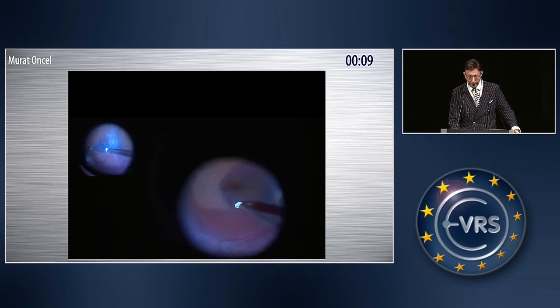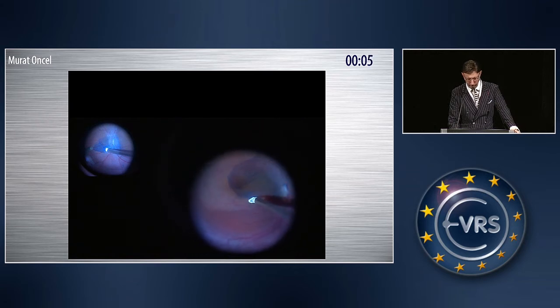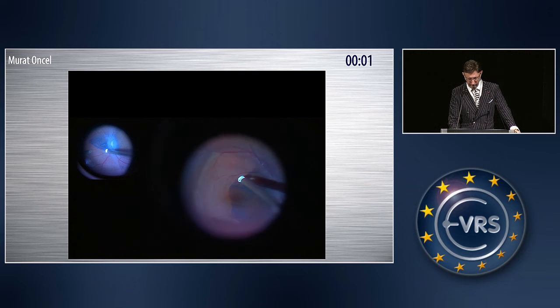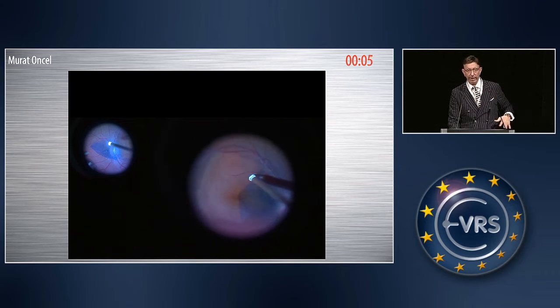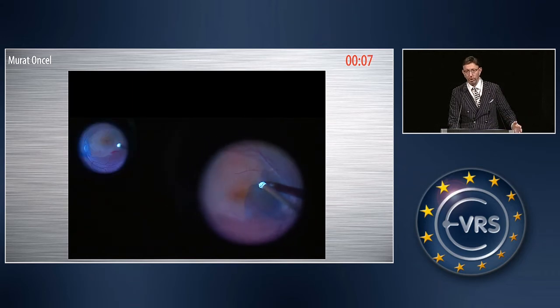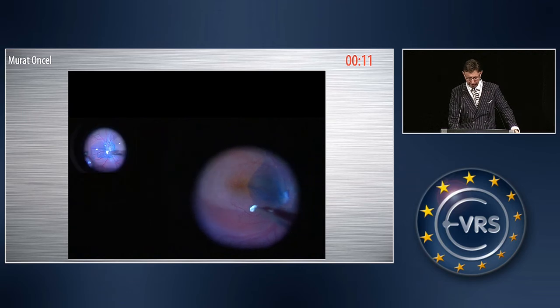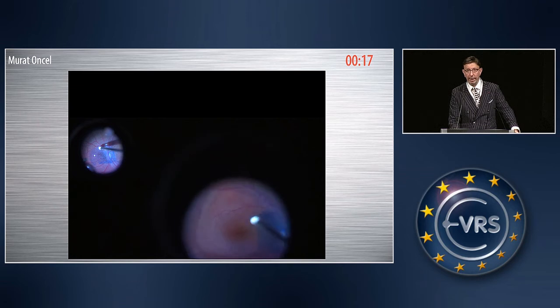The difference of this technique, besides the other ones, is that I used heavy silicone oil at the end. The only difficulty of this operation is to have this ILM flap in one piece so it covers the optic disc totally. I didn't stuff it into the optic disc — as you see here, the whole optic disc is covered with the ILM.